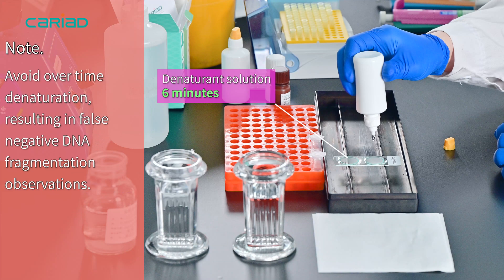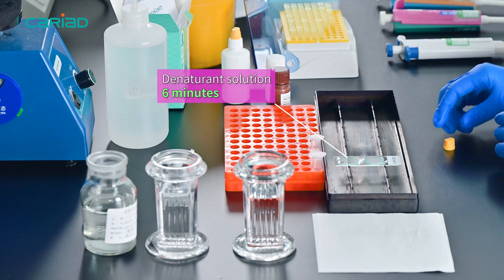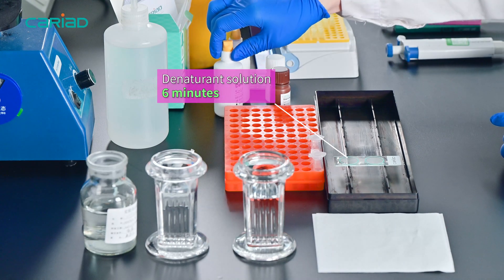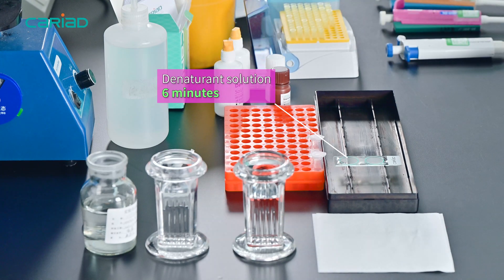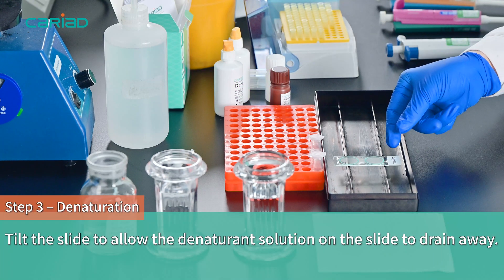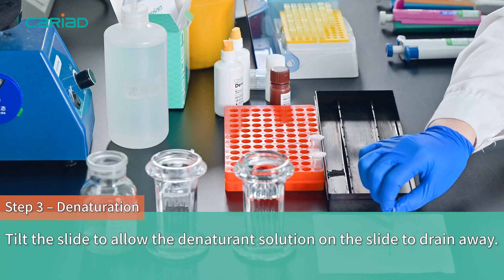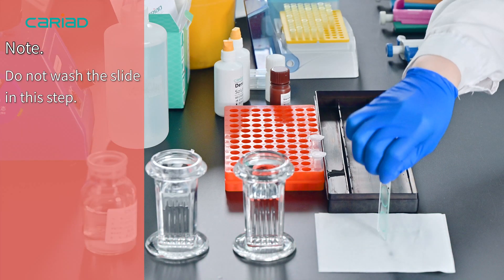Note: avoid overtime denaturation, resulting in false negative DNA fragmentation observation. Tilt the slide to allow the denaturant solution to drain away. Note: do not wash the slide in this step.